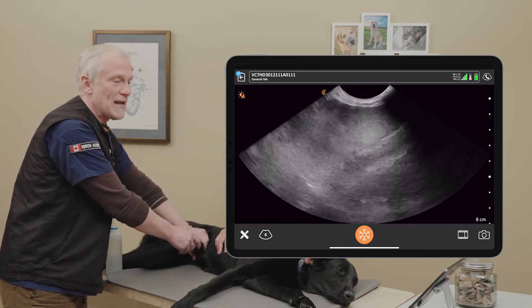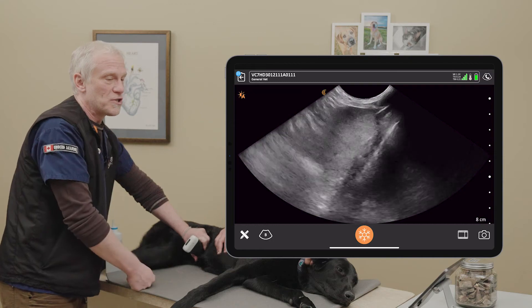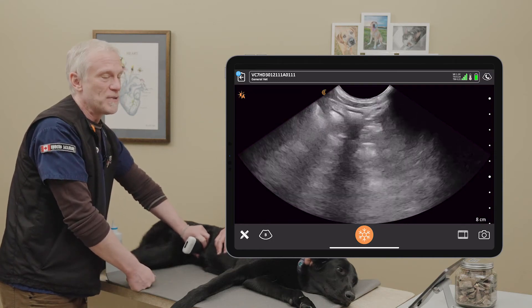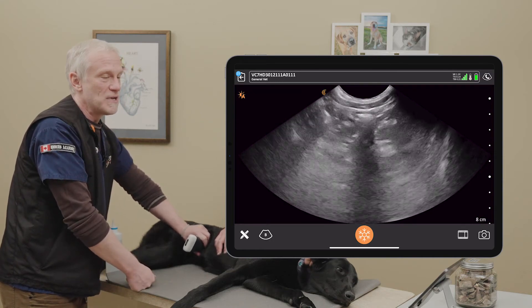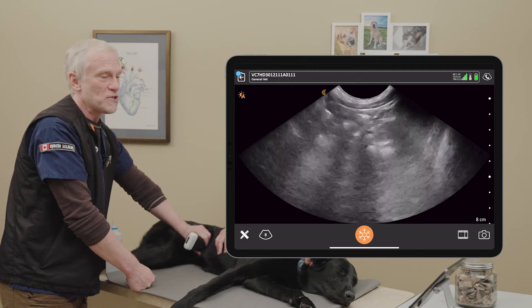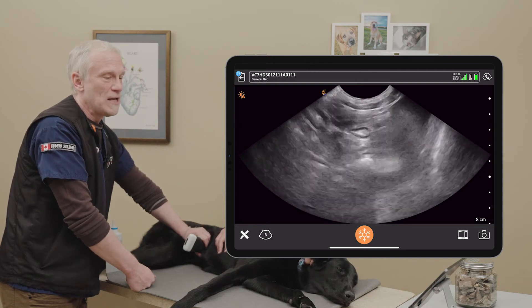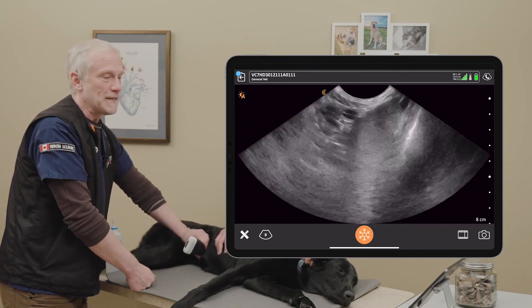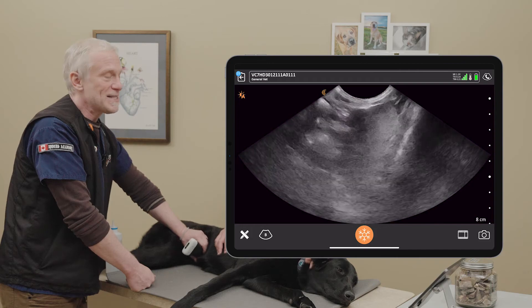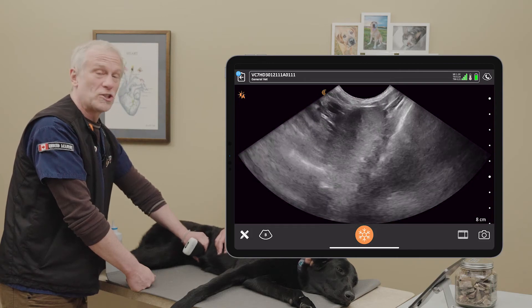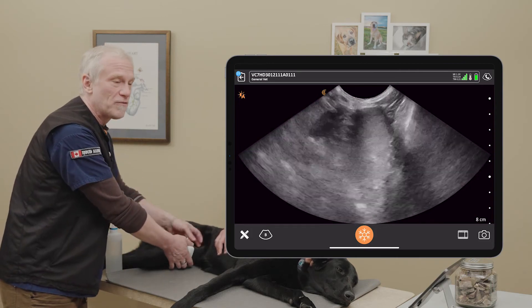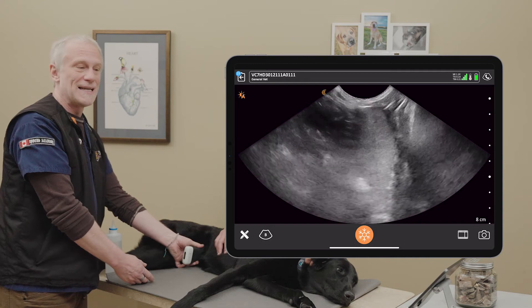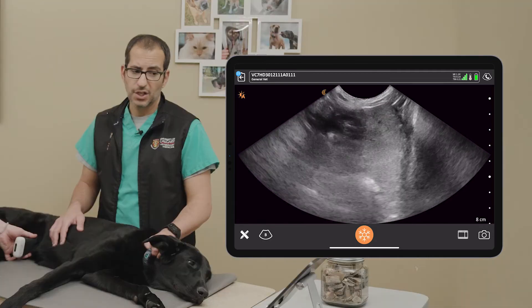Once we've done the long axis, we'll turn into the short axis just to make sure we haven't missed any pathology. You see some nice intestinal loops here with some shadowing, no obvious free fluid, and then again I can pick up that spleen. So that is our umbilical site, Dr. Shalhoub — essentially with the key component of looking for fluid, although we can also see intestine and spleen at this site as well.